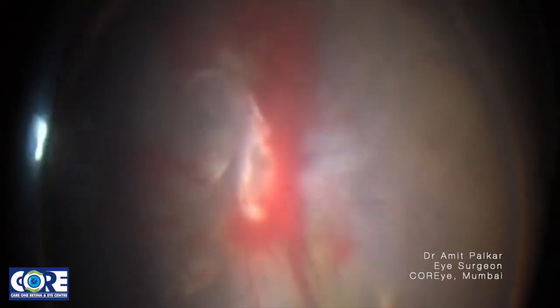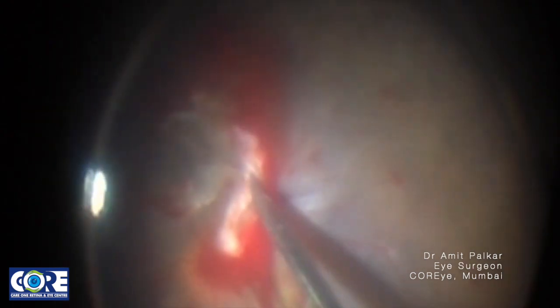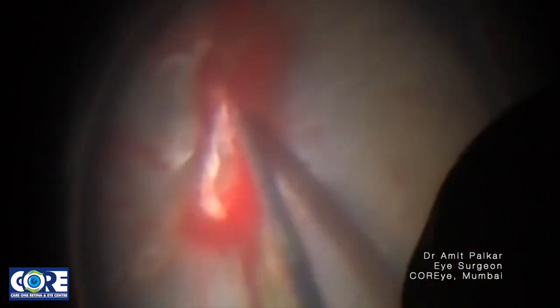Some more cauterization of the fibrous vascular proliferative lesion at the disc. Using the 24 gauge needle with the bend at the tip to further dissect the membrane.